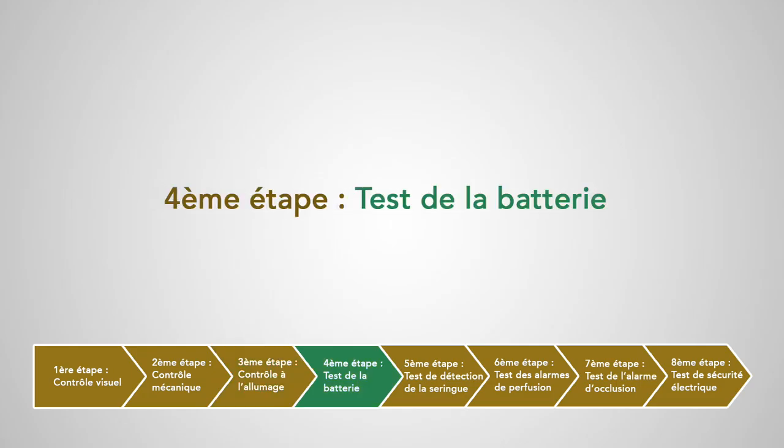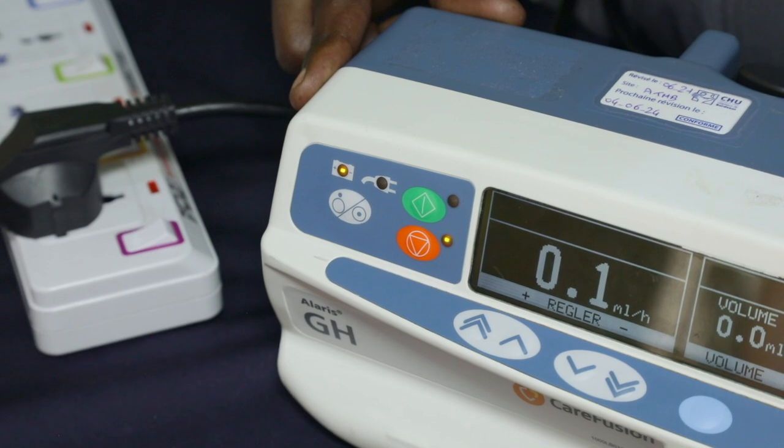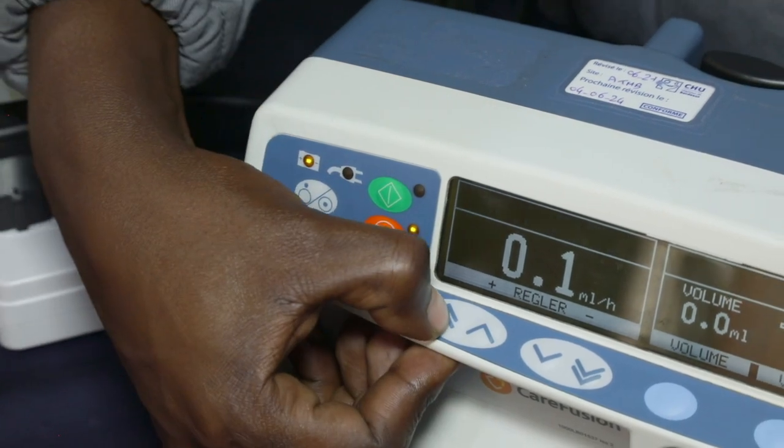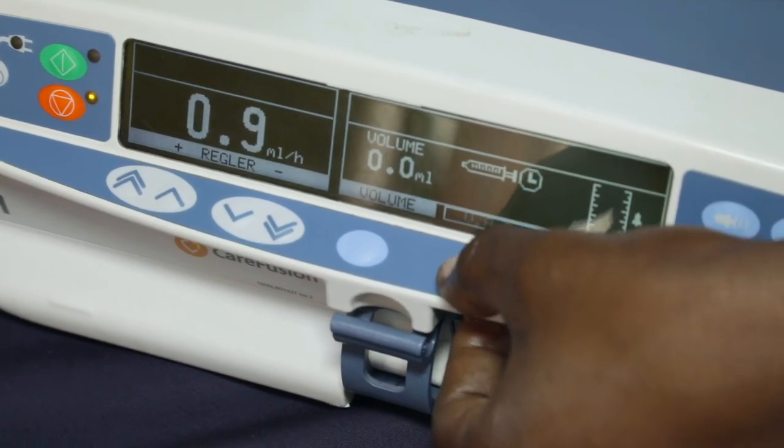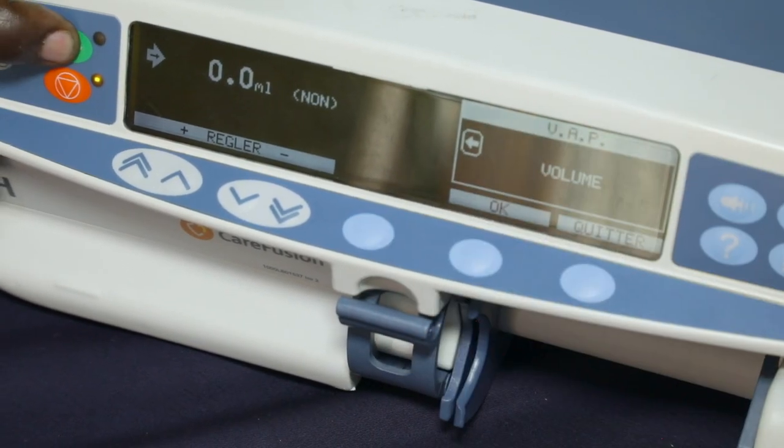Quatrième étape : test de la batterie. On va réaliser tous les tests suivants sur batterie. Si l'appareil s'éteint avant d'arriver au bout des tests, on va devoir changer la batterie.